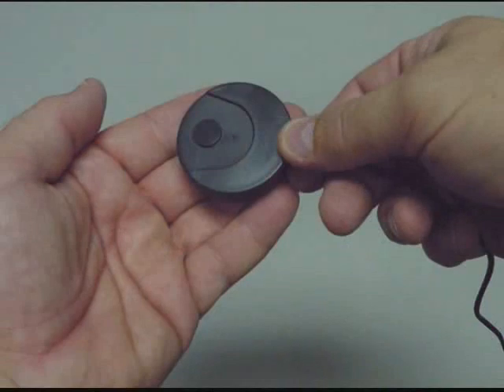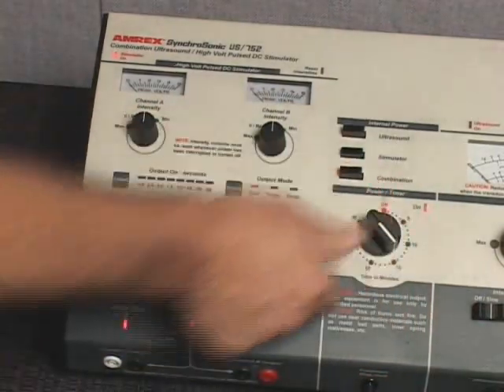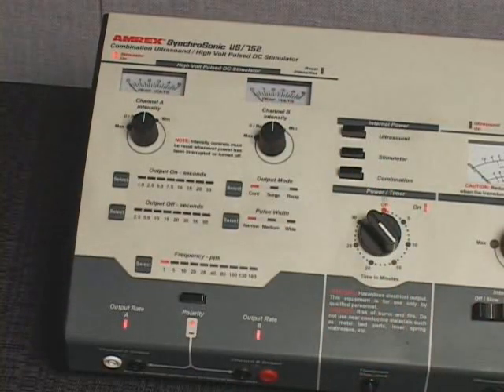Hand the patient treatment stop switch to the patient and explain its function. Rotate the power timer control knob clockwise and set it to the desired treatment duration. The power timer on, stimulator on, and the default treatment setting indicator lights will illuminate.